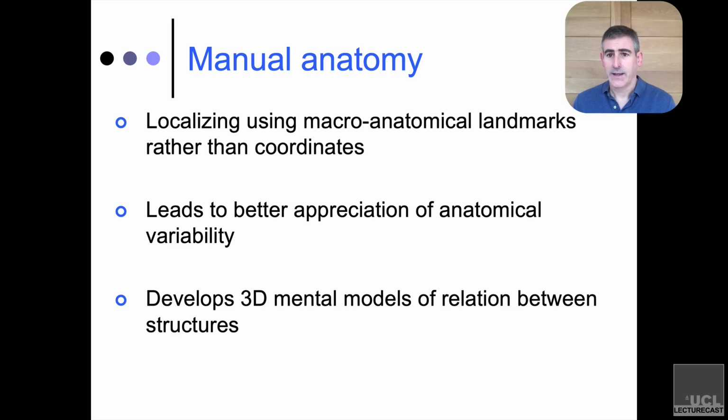Now, nonetheless, that's hard. And even if you're reasonably confident that you understand this area, you're probably going to make reference to some reference books, atlases, and there are a couple that I would recommend. But the importance here is that you're learning to recognize these regions based on their macroanatomic landmarks. That is to say, the gyri and the sulcal patterns, typically. It'll give you a much better understanding of the anatomy, but it'll also help you to develop an internal 3D model of how the anatomy is related to one another.